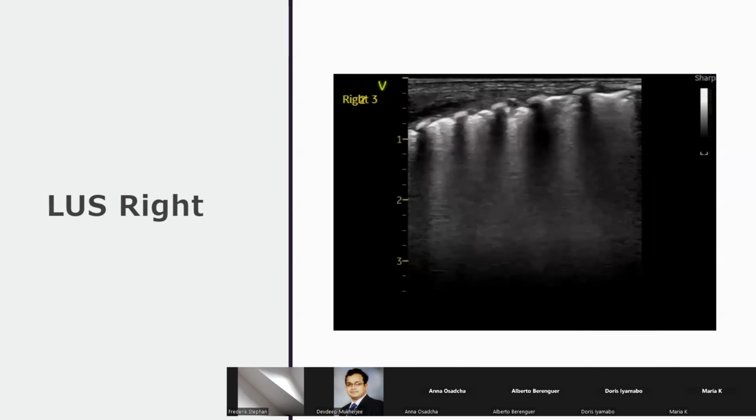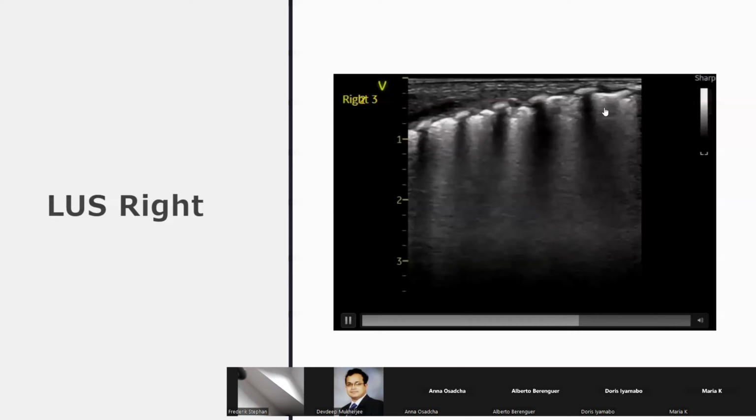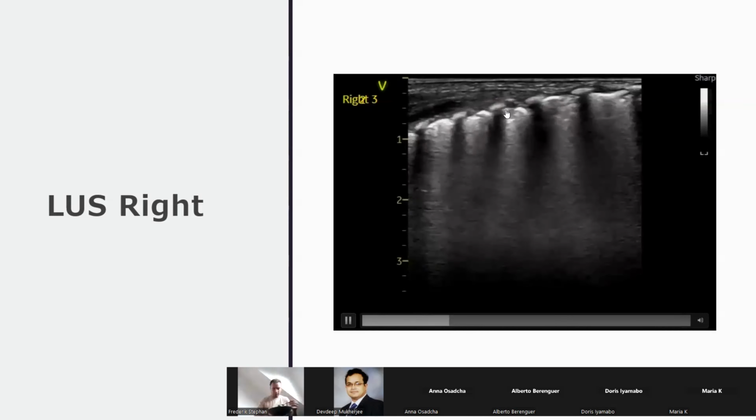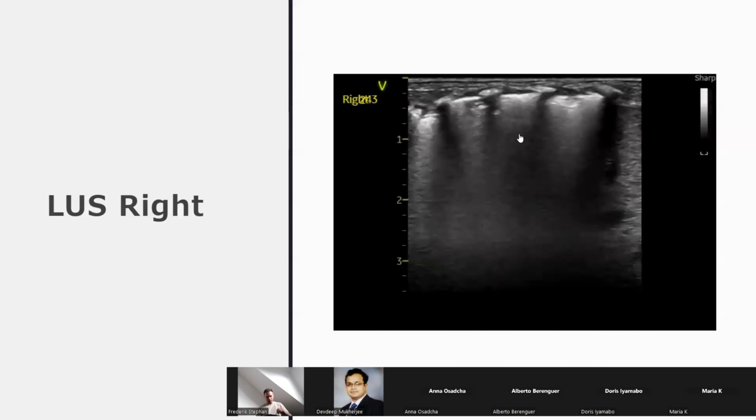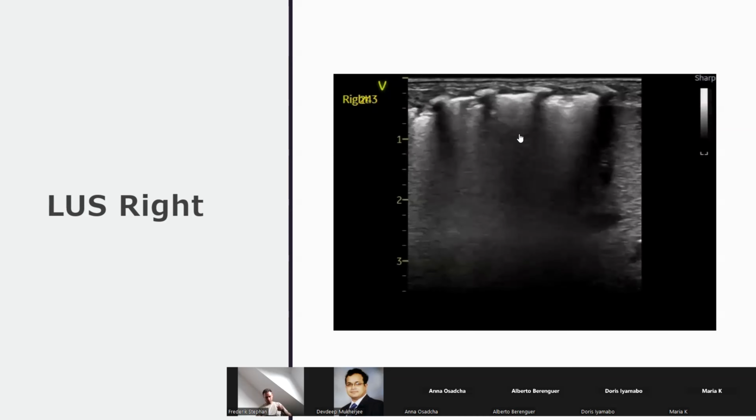Yeah, I can actually see it in the third intercostal space, maybe third and fourth, but they're very small. Not sure that's a fractal sign? I'm not very sure. I think we need to see the superficial area more, decrease the depth so you can focus in. It's not a fractal sign. Take my word for it. Okay, now we're going down to R4.